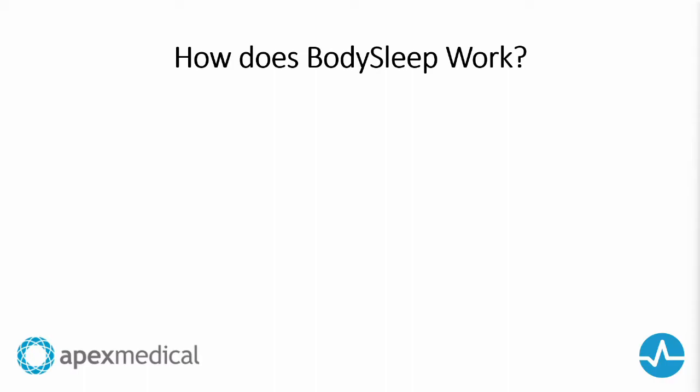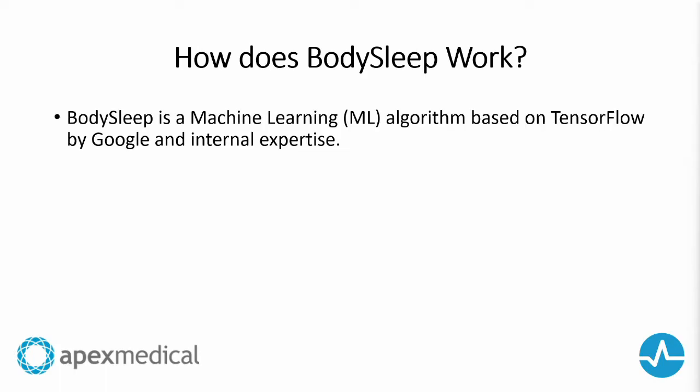I'm sure the next question is, how does it work? On the more technical side of things, BodySleep is a machine learning algorithm based on an artificial recurrent neural network trained using supervised learning. It's based on Google's TensorFlow program and internal expertise.